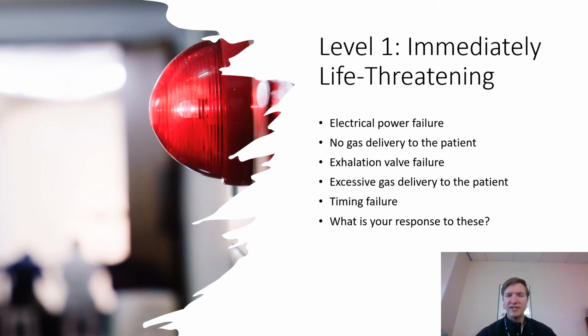It's great if you're at a facility that has the built-in compressors, and we have some of those in our lab here, but it's great if they do. However, if they don't, we need that pressure. We need to make sure that that patient is being adequately ventilated. So low gas source alarms usually can't be silenced, especially if the gas is critical to that ventilator's operation. They'll just keep going on until you fix the problem. So make sure the patient's being ventilated. Disconnect and bag them while you figure out why they don't have gas, right? Especially if you can't rectify the situation immediately.